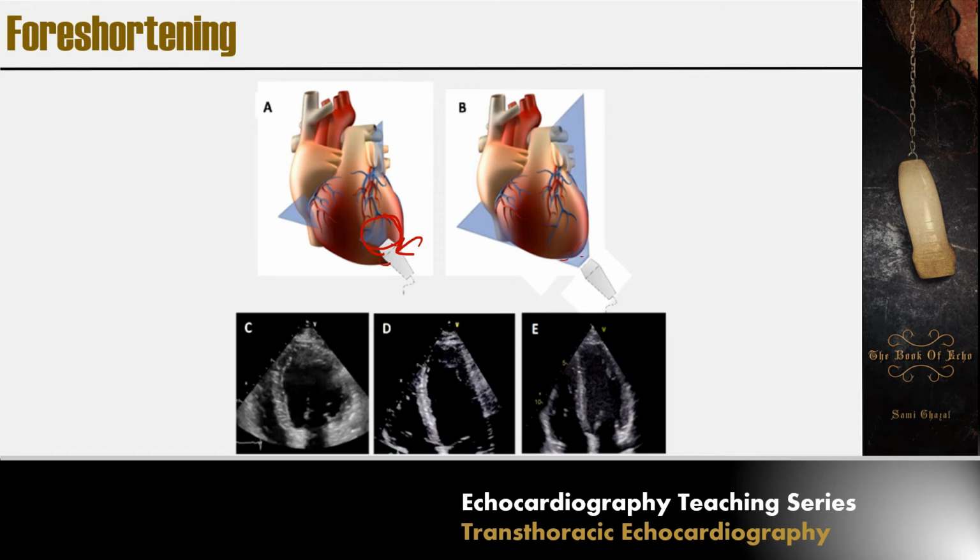So when you see your view, in order to determine if this is a true apex or not, you have to know the following criteria.